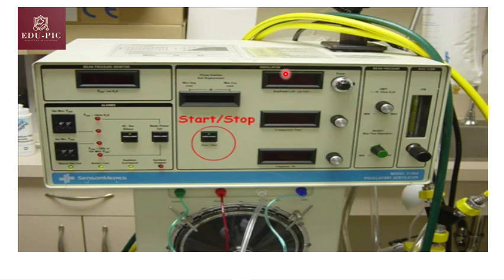Here is the button and here is the monitor. Here is the monitor for MAP. You set from here and you see here the number. Here is start and stop. Here is the piston position and it should be oscillating around this midline. Here are some alarms. This is a maximum airway pressure and this is a minimum airway pressure.